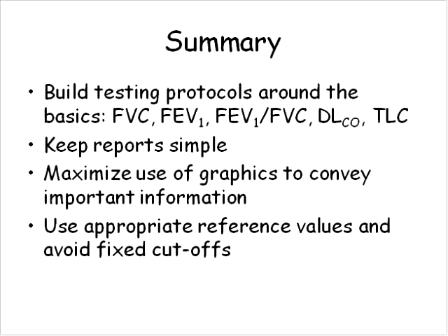If we have plenty of time, we usually opt to not do that, but in the interest of time, sometimes it's more efficient for the patient and everyone involved to do the DLCO while the patient is bronchodilating. And I don't think that there's a great deal of information available to support or deny doing it one way or the other.